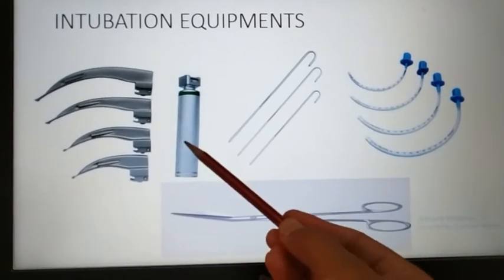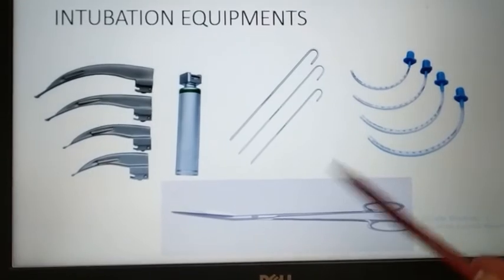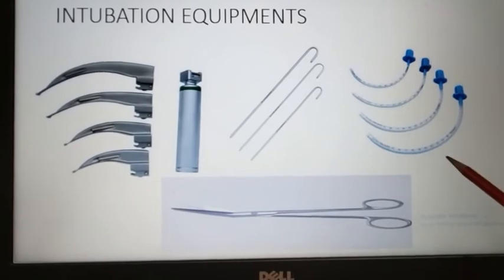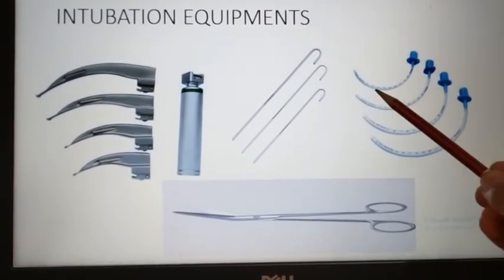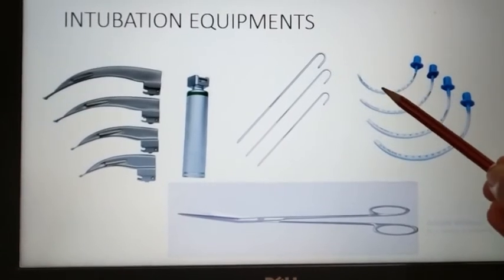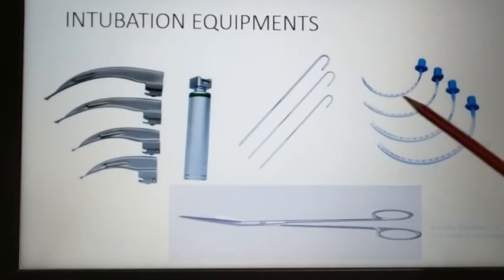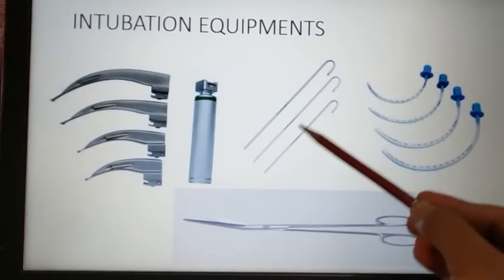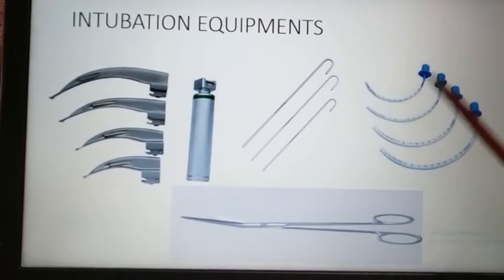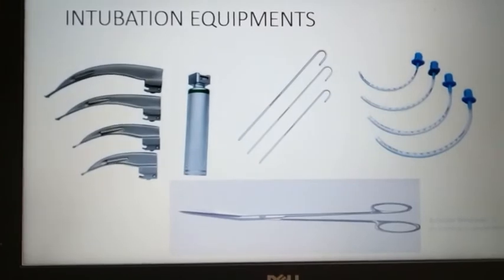This is a laryngoscope with blade to visualize the larynx. This is the ET tube, that is endotracheal tube, available in different sizes. To insert the endotracheal tube — since it is an elastic and radiopaque tube — we need a stylet so that the tube will not go here and there. That is the stylet, and this is the scissor to cut the tube.